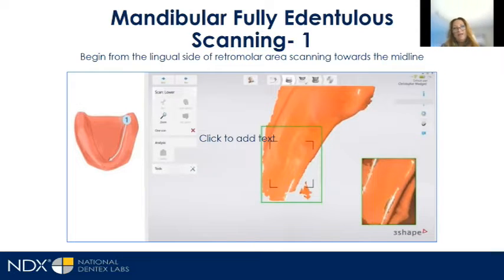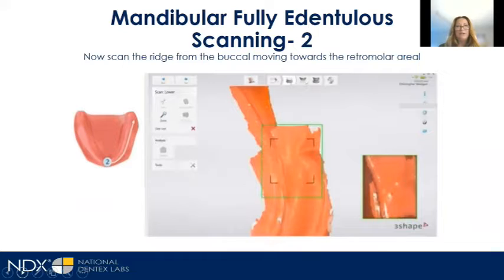It is a little tricky to begin with, but once you get it down, just don't give up. Just keep going at it. I know that you'll be able to get it down, right? After you get done moving it, you can roll along the vestibule and capture the images that you need.